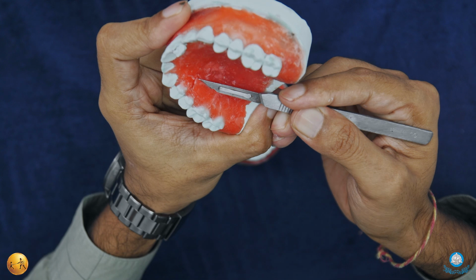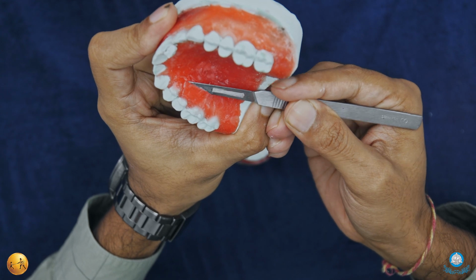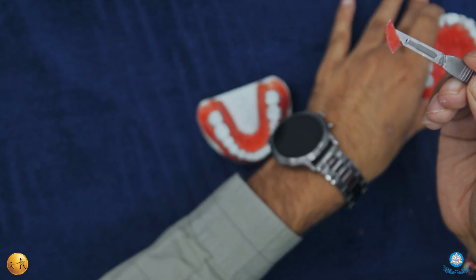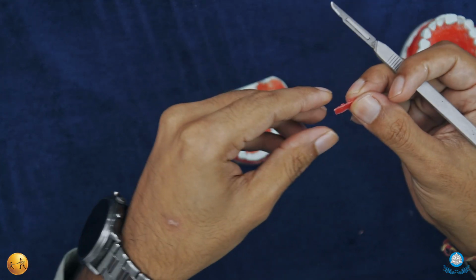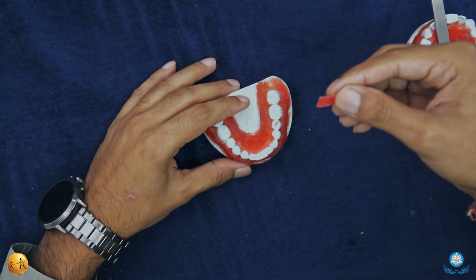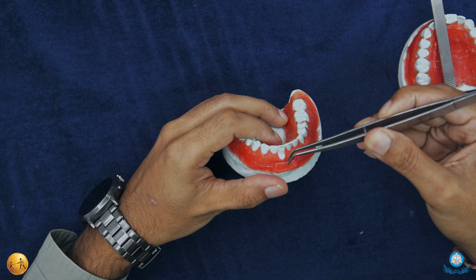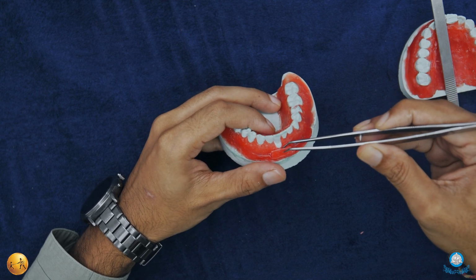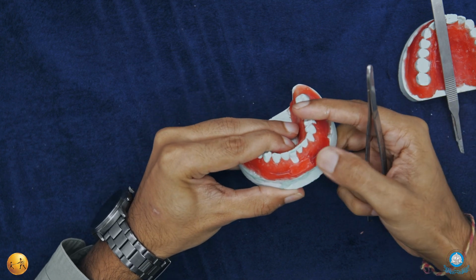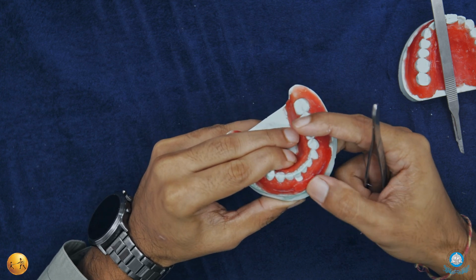So you release the graft from all the sides, what you had bordered initially depending on the template based on what recipient site was prepared, and now this graft can be taken. That was the second step. First step was preparing the recipient bed. Second is to harvest the graft. Third is to adapt this graft onto the recipient site. You can use tissue forceps, and this will be the site where the graft is placed and firmly adapted onto the recipient bed. That is because you don't want any dead space between the recipient bed and the graft.